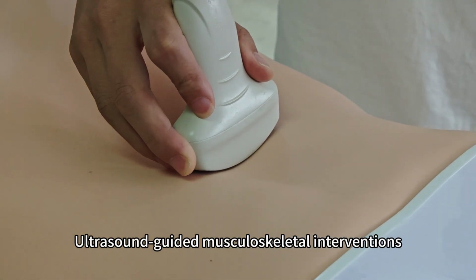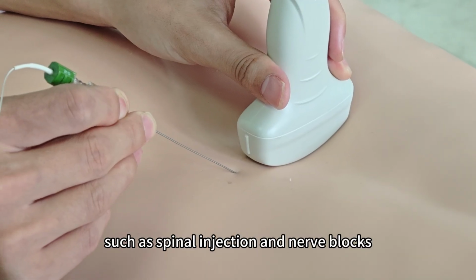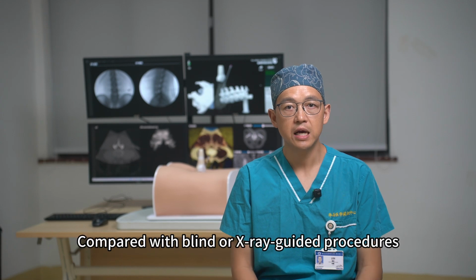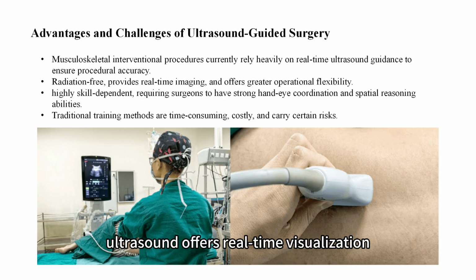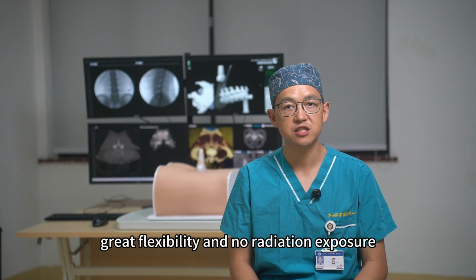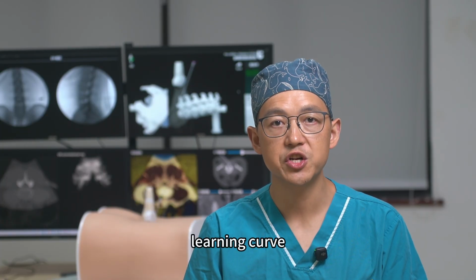Ultrasound-guided musculoskeletal interventions such as spinal injection and nerve blocks are increasingly important in orthopedic and pain management. Compared with blind or X-ray guided procedures, ultrasound offers real-time visualization, great flexibility, and no radiation exposure. However, these benefits come at the cost of a steep learning curve.